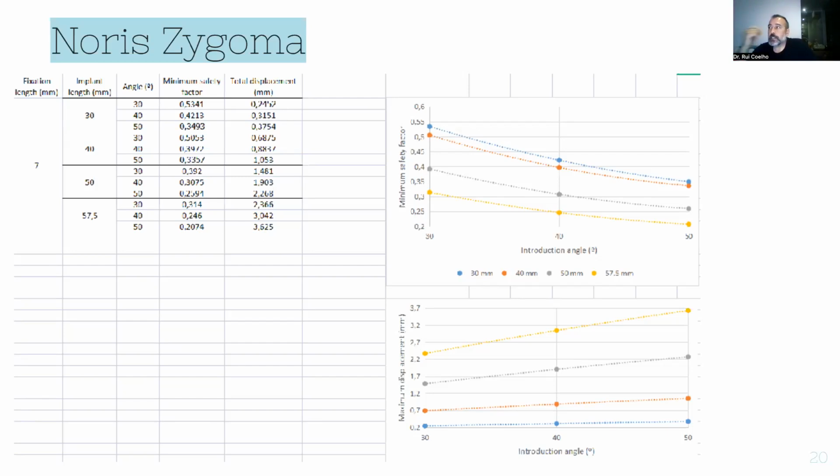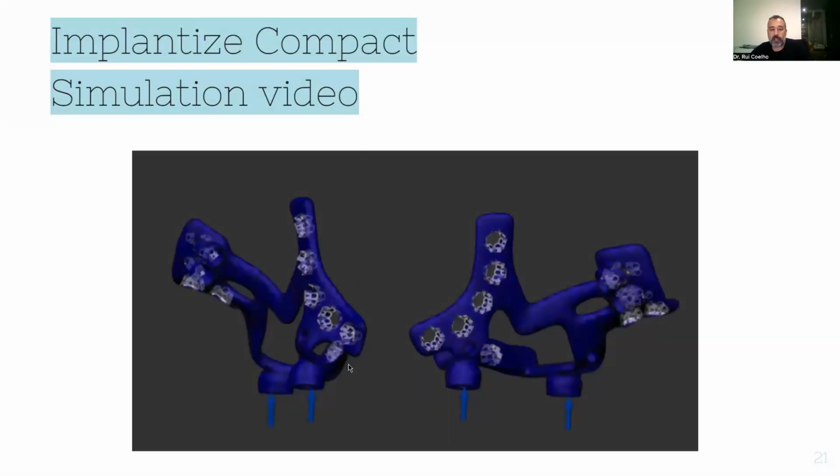So this is much nearer to subperiosteal implants, because of the movement that it induces, and that's why we see at the end of some years that there is a big resorption of the sinus wall, and also it starts to have communications. But with us, what we did is that we applied the constraints.